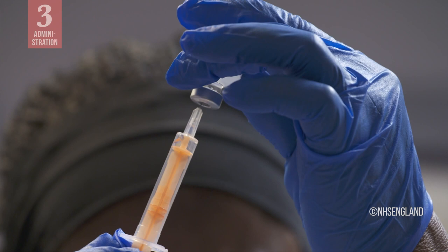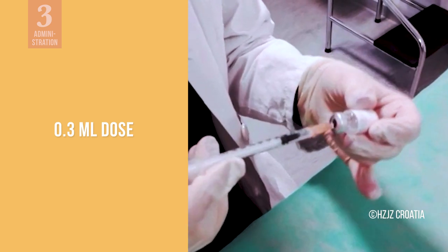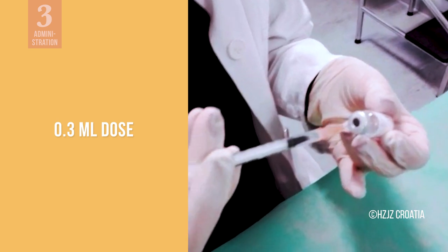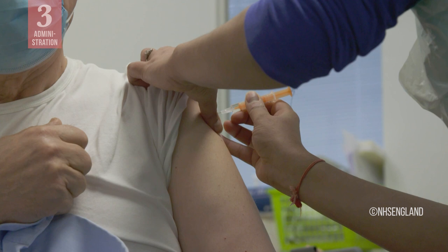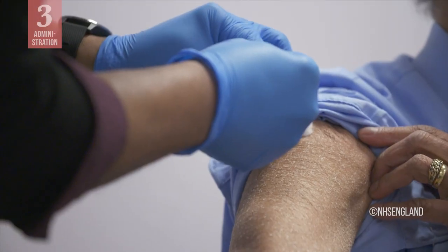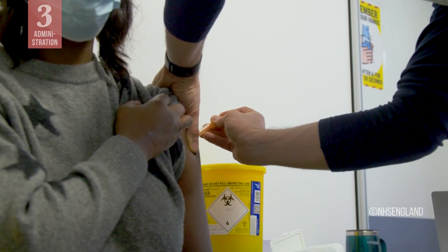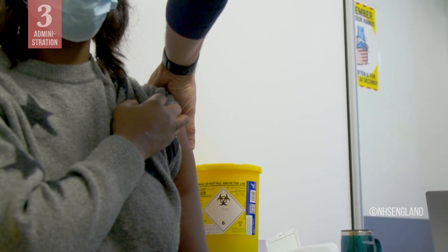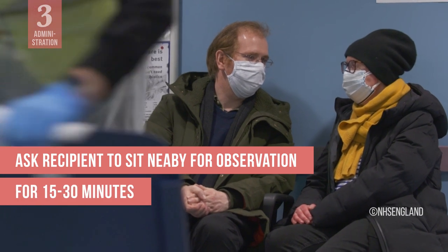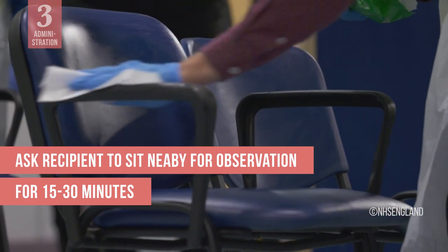To administer the vaccine, draw up a 0.3 ml dose of the diluted vaccine into an auto-disable syringe. If you need to make any adjustment to remove air bubbles, do so while keeping the needle in the vial to avoid wasting any of the vaccine. Use an intramuscular injection technique to administer the vaccine into the upper arm of the recipient. Follow safe injection practices to avoid any needle stick injuries. Dispose of used syringes and empty vials in a safety box. To ensure the vaccine recipient's safety, ask them to sit nearby for observation for 15 minutes after the injection, or for 30 minutes if they have ever had any allergic reactions in the past.